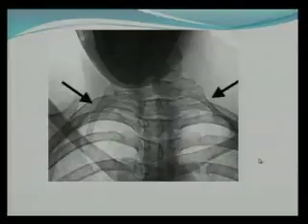So the most common cause, which we normally see, is having cervical ribs. Cervical ribs can be bilateral or unilateral, and cervical ribs vary very much on how much is the osseous component of the rib and how much is the fibrous component of the ribs. Whenever you begin a battery of investigations for a patient with suspected thoracic outlet syndrome, start with a chest x-ray. You see bilateral cervical ribs, you're done. You know that is the cause of thoracic outlet syndrome.